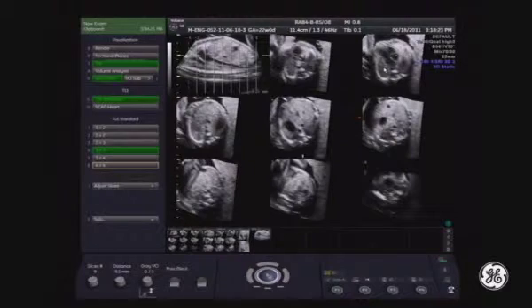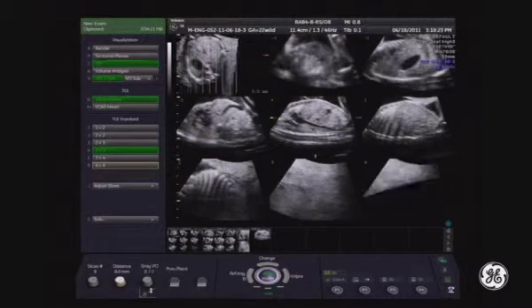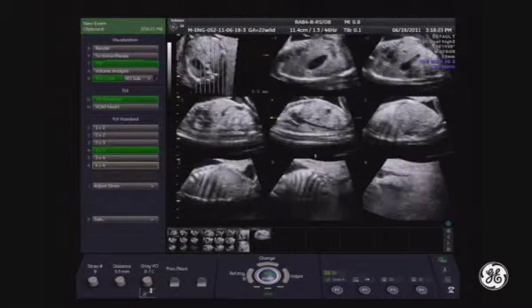You can present the fetal trunk in sagittal sections the same way. So let's try to do it. We'll select just the reference image B. You remember that the distance in the axial cuts was bigger. Here we need to reduce it. Here we are.